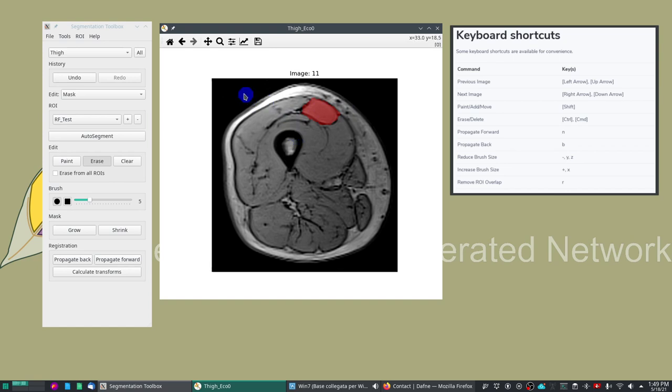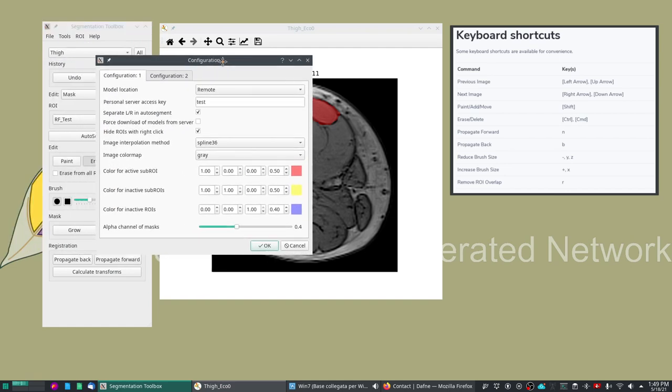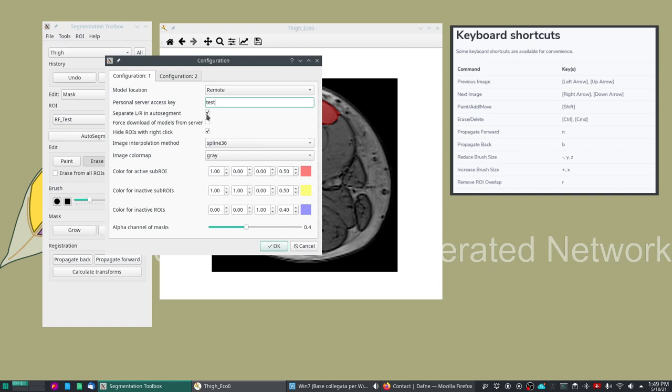To do this I will initially show you the preference dialog. In the preference dialog the most important preference that you will want to set is your personal server access key. In this case we've used test but this will not work after this demonstration and you will need to request your own. There are also some other options, an important one is the separation of left and right. This is relevant for our models because they work on left and right legs.